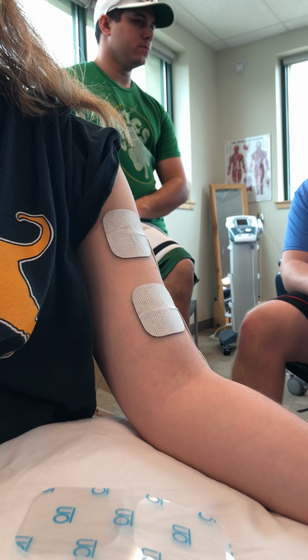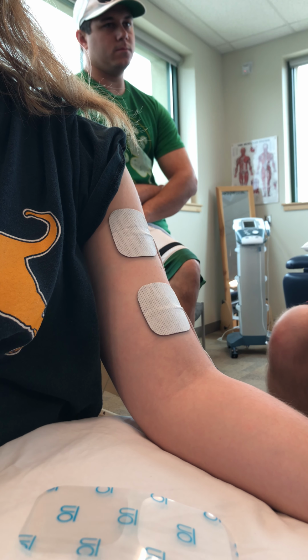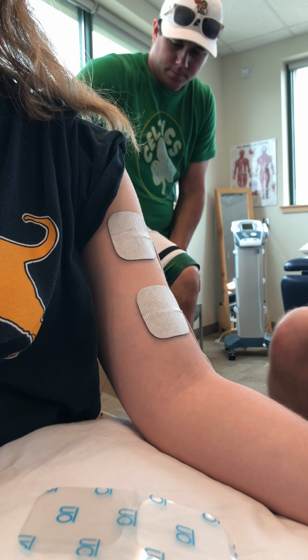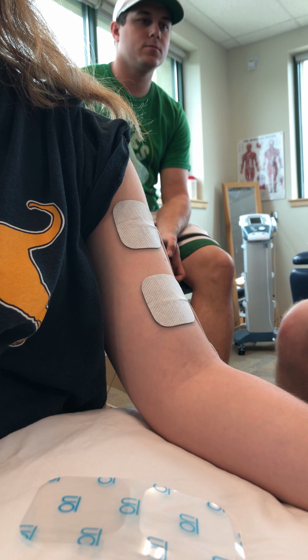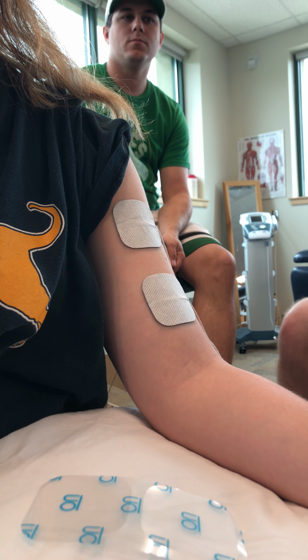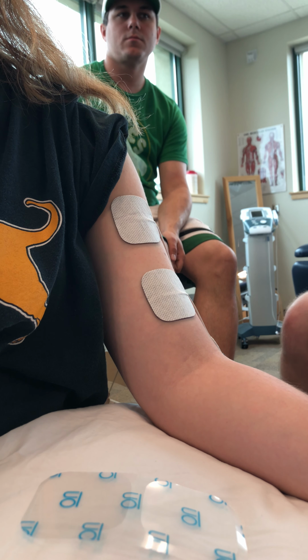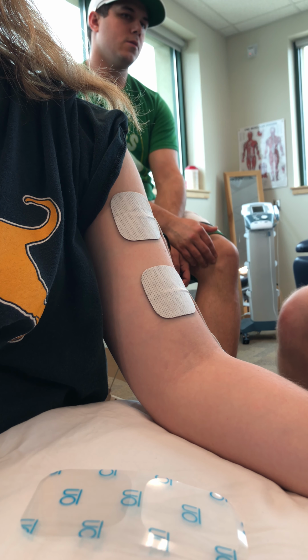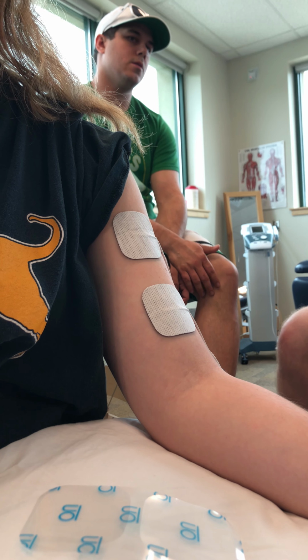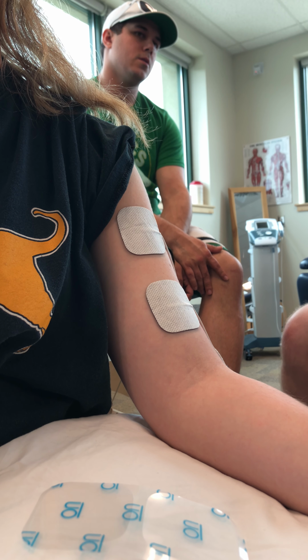So Alyssa, when I increase the intensity here, you're gonna let me know first. You're gonna feel a tingling sensation. It's gonna get stronger and stronger till we actually see the muscle contract or pull a little bit, and then we can get it literally as strong as it will do the whole motion for you. But it has to be within your comfort range.